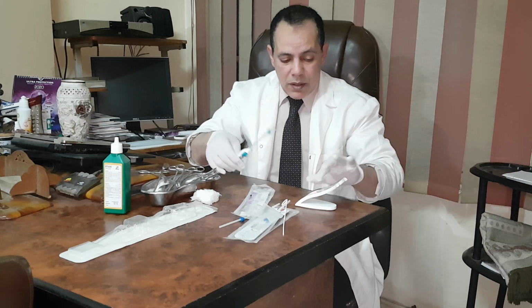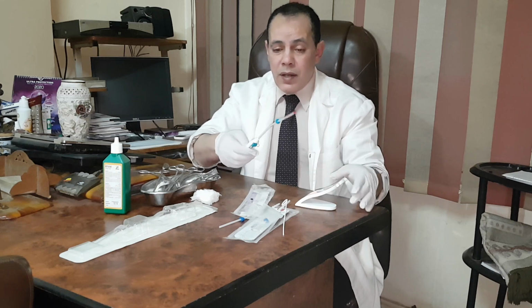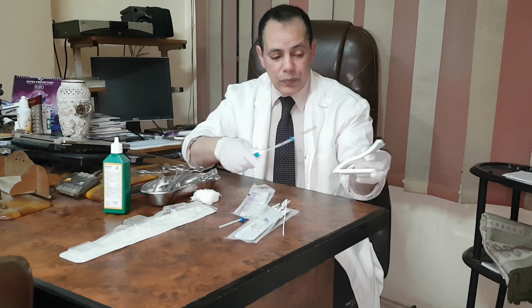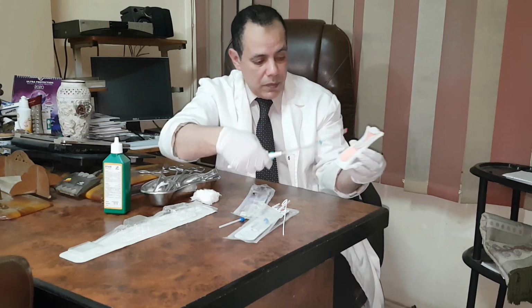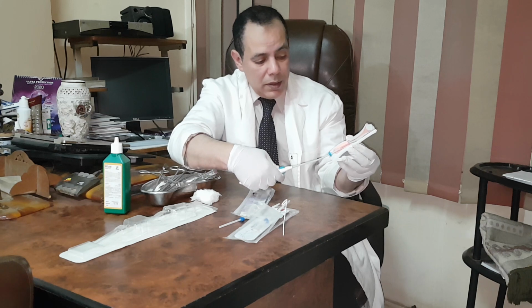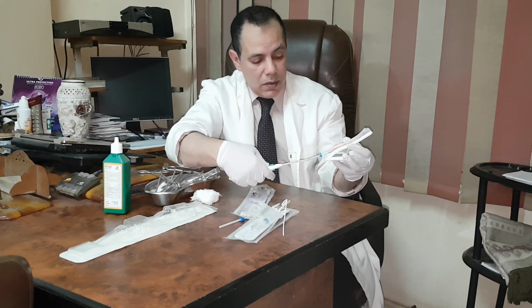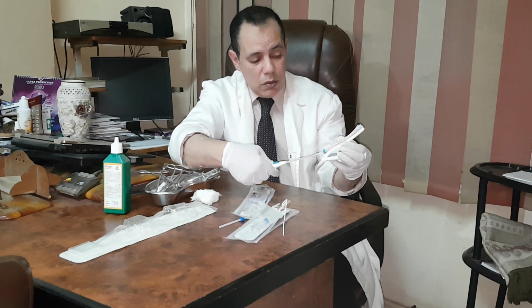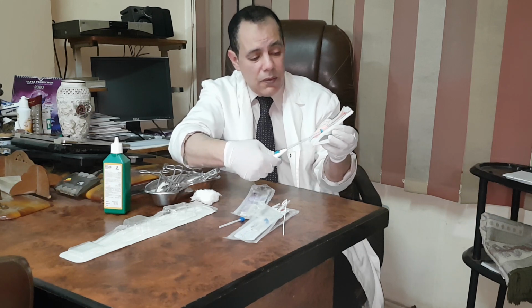You measure the length of the uterine cavity as previously by ultrasound. You hold the anterior lip of the cervix. Then you want to insert Mirena inside the uterus. So, look at this, please. You will insert the sheath, or the tube, inside. The first resistance you meet is the internal os. The second resistance is the fundus.